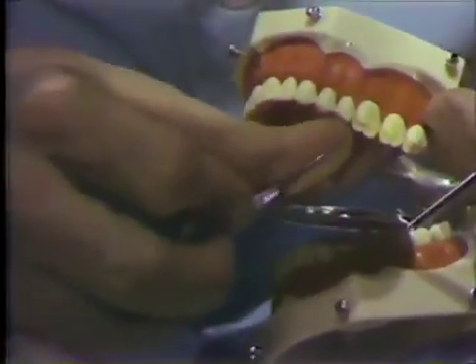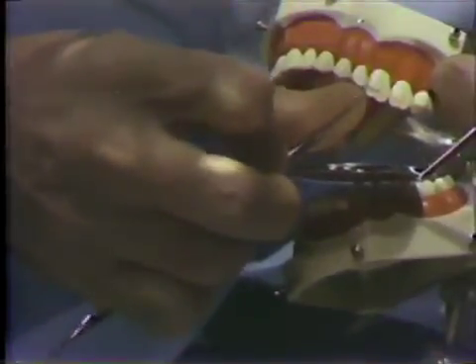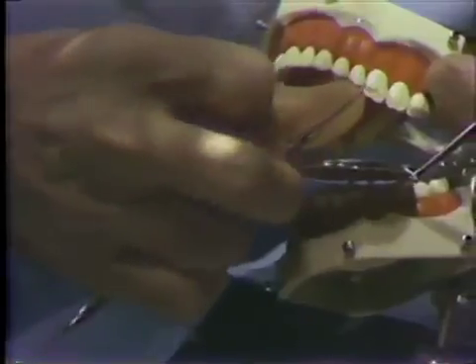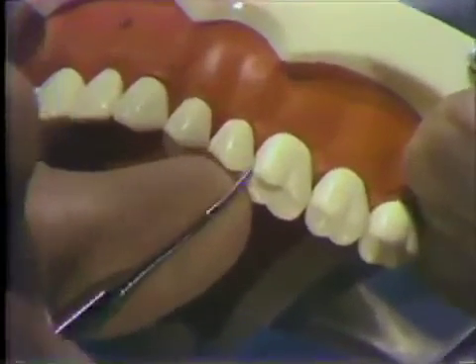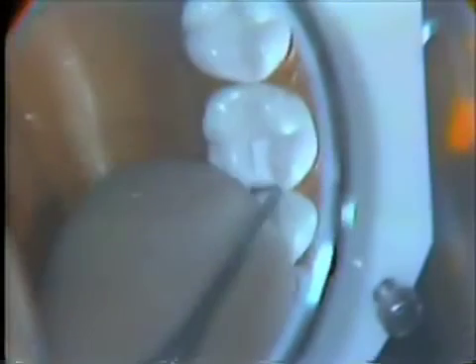Switching to a Class II amalgam preparation on the mesial of tooth number 14 and utilizing a Wedelstat chisel in the refining of the buccal proximal wall, the action of the instrument with the mirror and utilizing a palm and thumb grasp is the support of the instrument against the thumb or on the ball of the thumb, with a slight rotating rolling action down the buccal proximal wall into the cervical floor, defining the buccal proximal cervical axial line angles. The Wedelstat has a blade angulation of about 3 degrees.